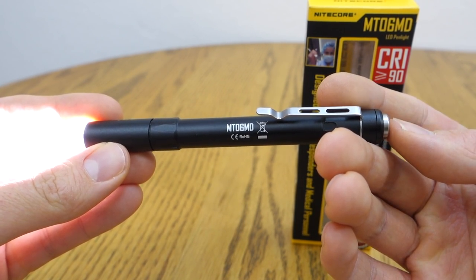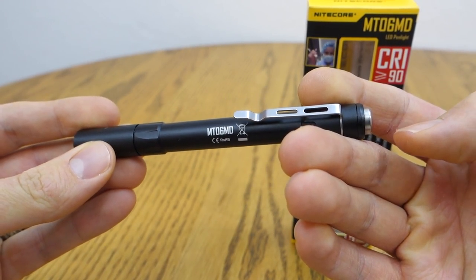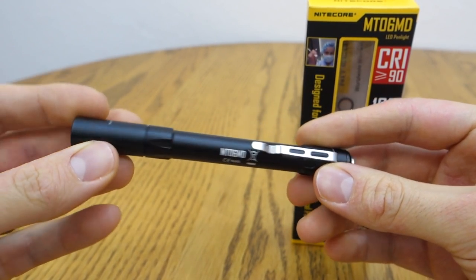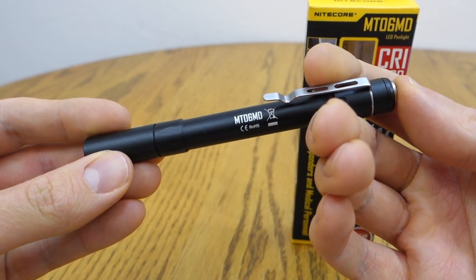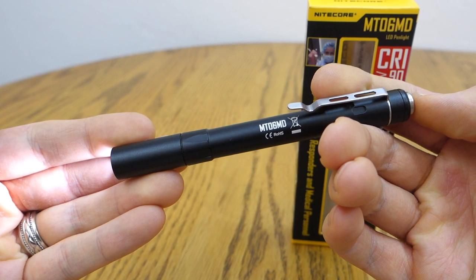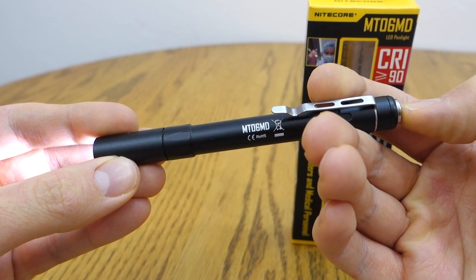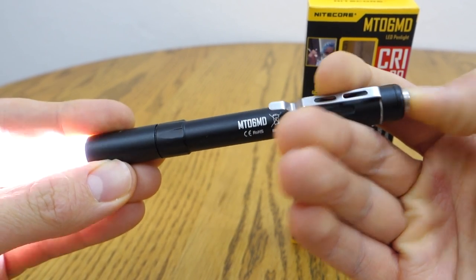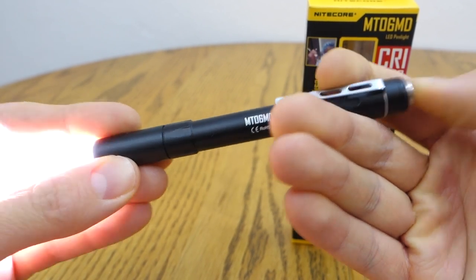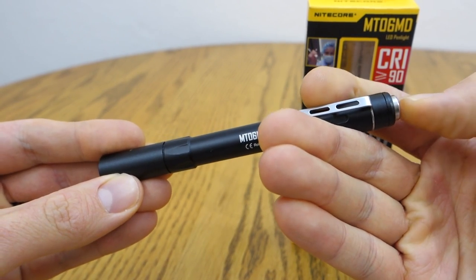To turn off the light, you simply click it off at any time. If you wait three seconds or more, it'll turn back on at low. You can also advance the light by doing full presses a little more quickly — to go to the next mode, then high, then back down to low, and so forth.